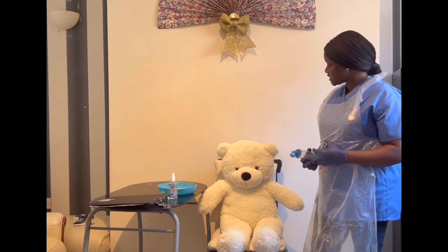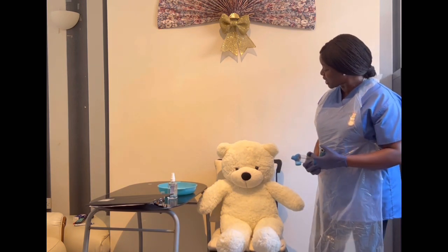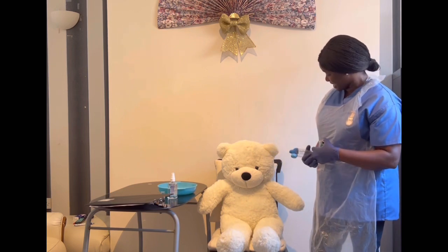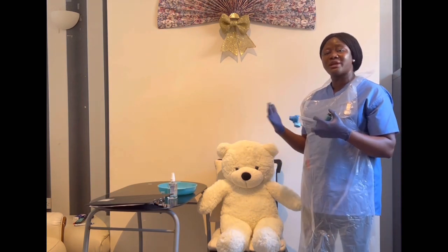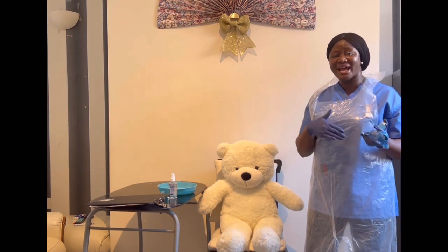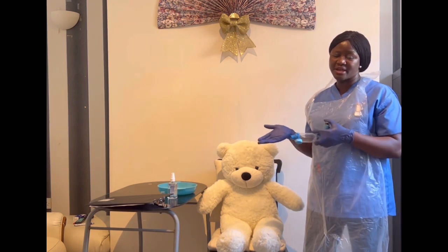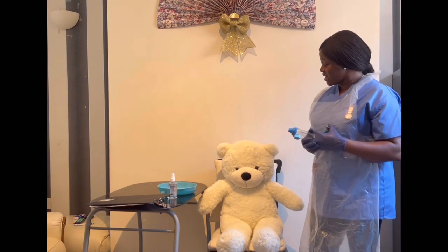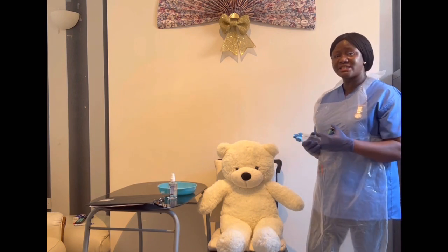Wonderful, Harry. So we need you to take a rest for 20 to 30 seconds because we're giving the same form of medication. But if I have to give a different kind of medication, for example, a bronchodilator and a steroid, we need to wait for 2 to 3 minutes. Okay, so 20 seconds is over.